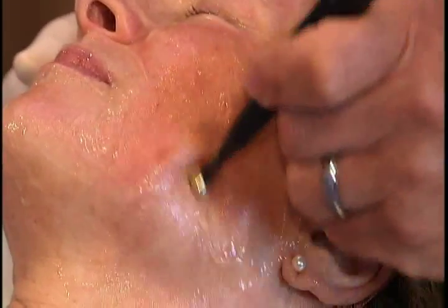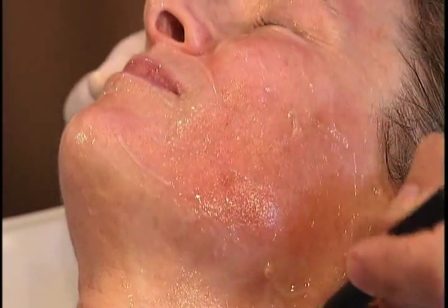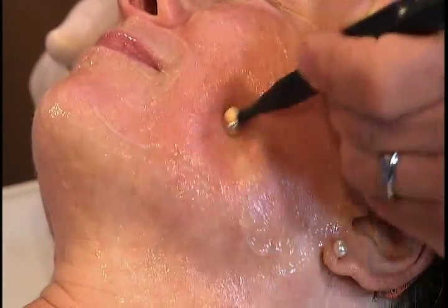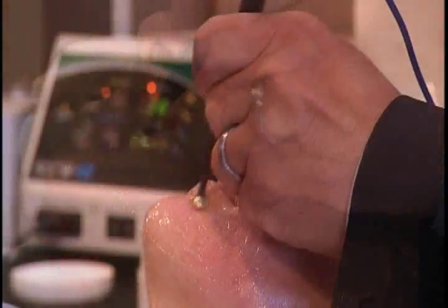And you can see it doesn't matter if I'm doing circles. I'm controlling the tips so that I don't go flying off and causing a spark. I'm pressing firm enough that she probably feels like she's getting ironed, but it's not painful.